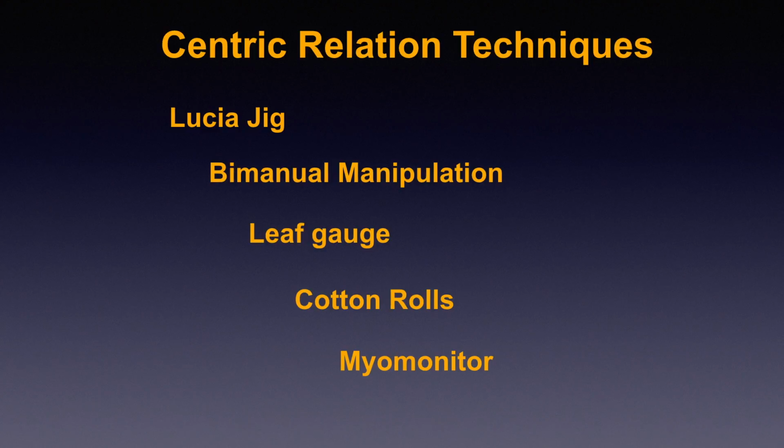The myomonitor is taught by Dr. Chang at the Las Vegas Institute, and we think it records a protrusive position and is therefore irrelevant to attempts to locate centric relation. Dr. Vic Lucia suggested the use of his jig to the profession, I believe, in 1964.